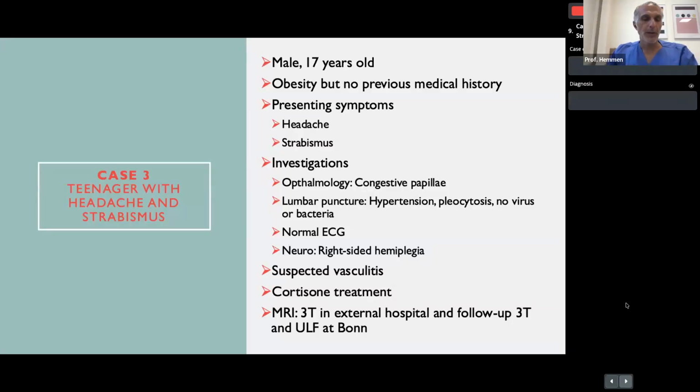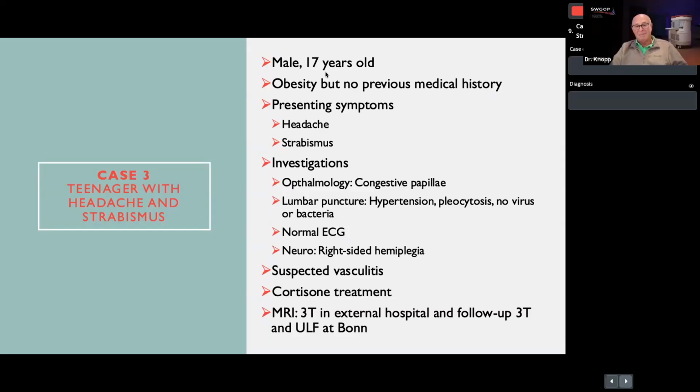Okay. So this case probably shows the whole range or umbrella of patients that we're treating as pediatricians and neonatologists, because it's a 17-year-old boy, and I was on call when he came in. He was 110 kilos, so I don't know how much that is in pounds or stones or whatever measure you take, but it's heavier than I am for sure. So, a big boy. Yes, it's a big boy, and it was very funny when I asked him which class in school he goes to. He said, "I'm not going to school.